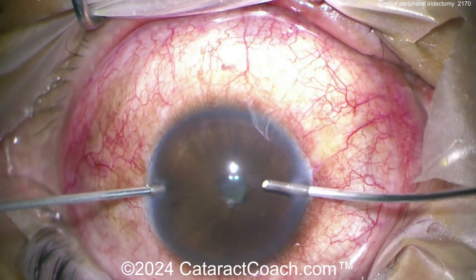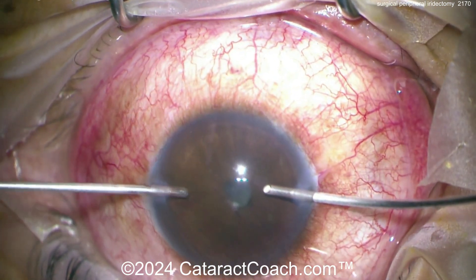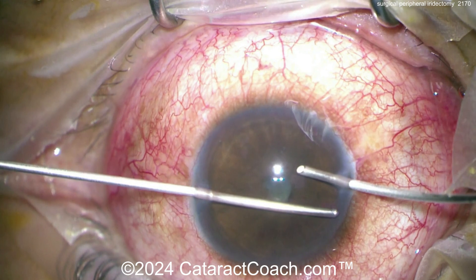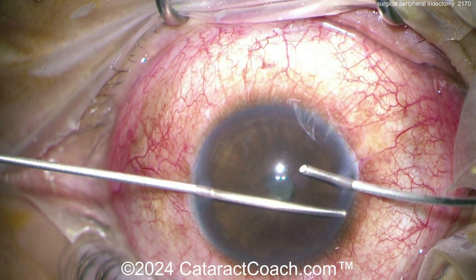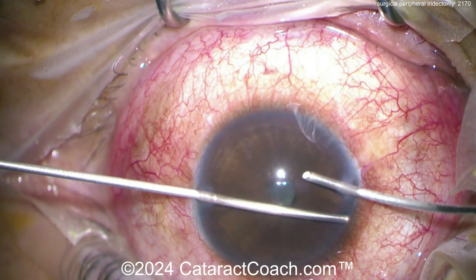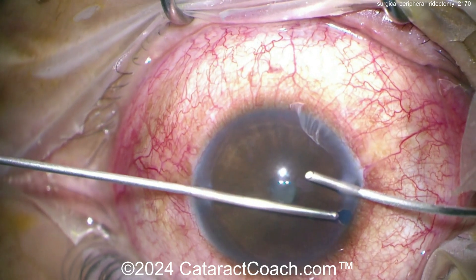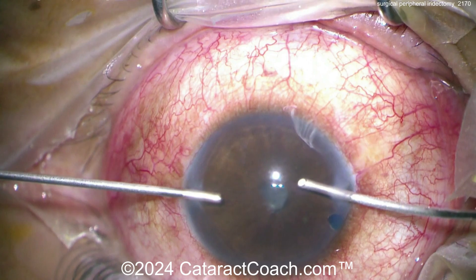You want it on I-A-Cut: position one on the foot pedal is irrigation, two is aspiration, three is cut. Use a very very low cut rate — at most 50 to 100 cuts per minute — that gives you about one or two cuts per second. Come in, aspirate first on position two. See the iris pull into the port. Once the iris is in the port face-down, go to position three — just one or two clicks — and now you've got a nice small peripheral iridectomy. Beautifully done.